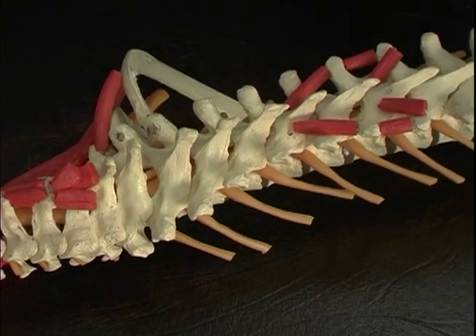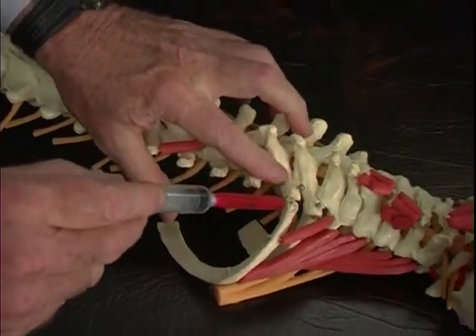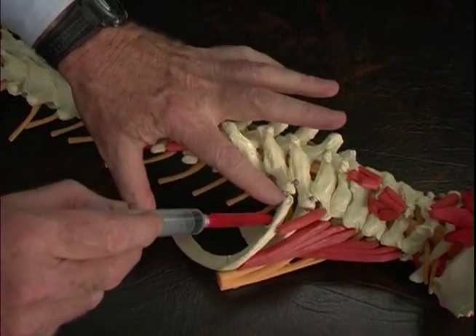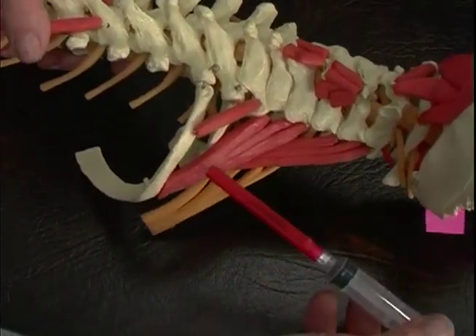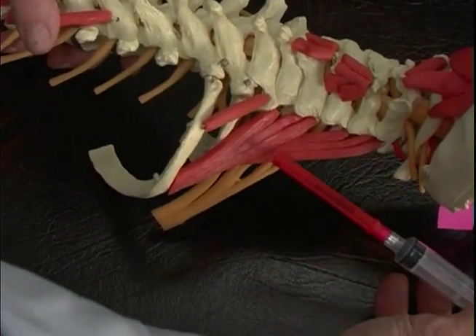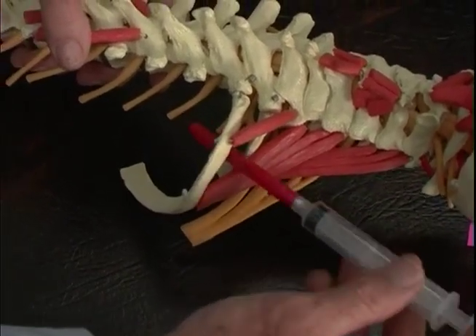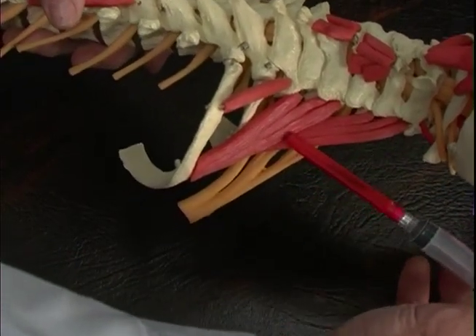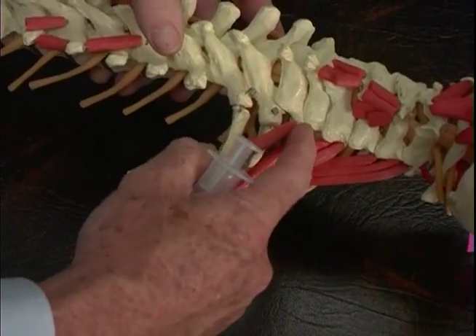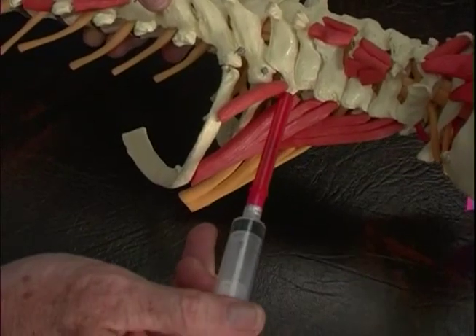Our next injection is the ribs and the rib transverse process junction. And so we can see the rib transverse process junction here of the second rib and the first rib up here. We mentioned one of the approaches into the second rib and first rib coming posteriorly and upward to avoid the apex of the lung here. Coming posteriorly and upward, we'll hit that second rib in the trapezius, and we'll hit that first rib after we've come off the C7 tip of the transverse process, which you can see right there.